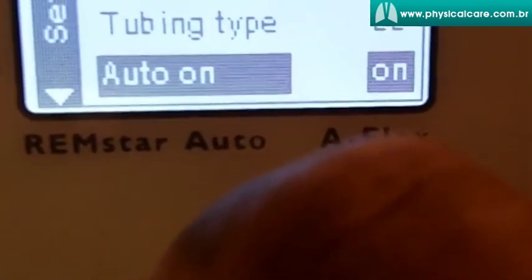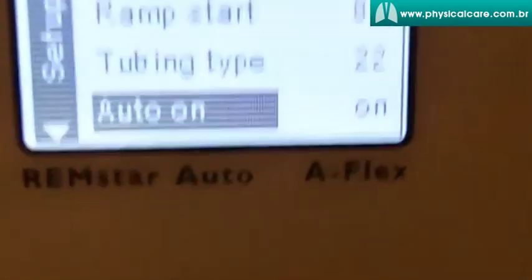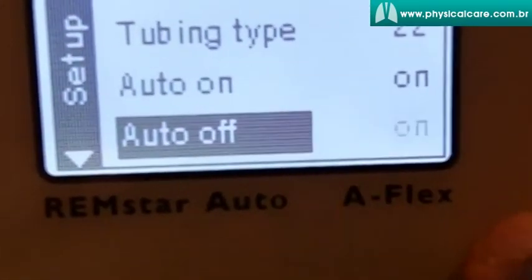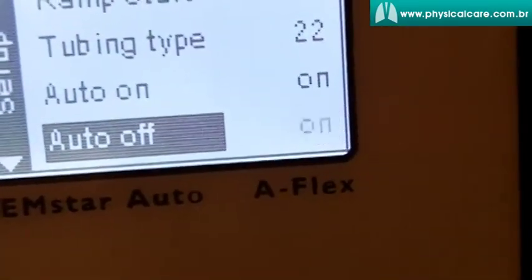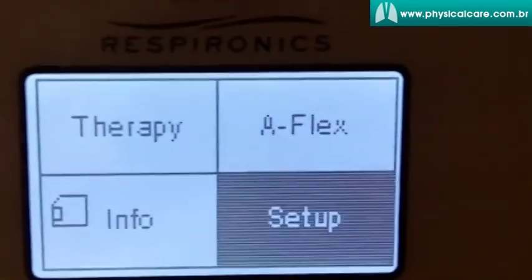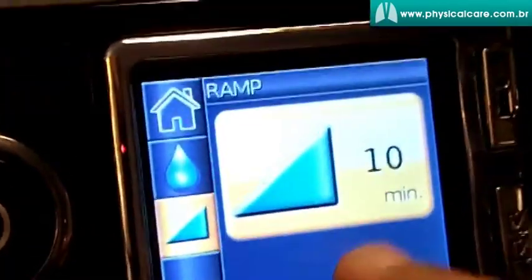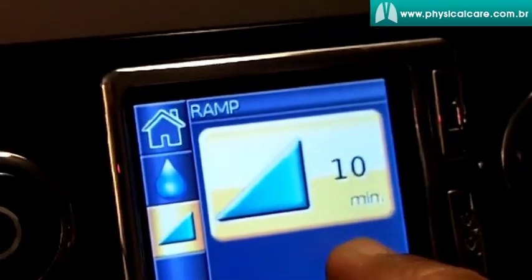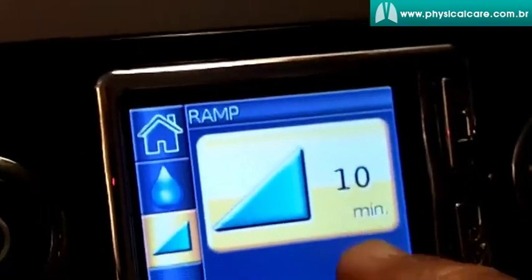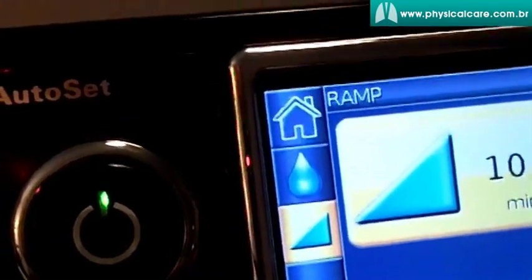Auto On — you can turn it on here, meaning all you have to do is put the mask on and start breathing and the machine will turn on. If you set Auto Off and turn that on, all you have to do is take the mask off your face and the machine will stop blowing air. The ResMed has that same feature; however, you cannot control it the way I showed you here — once the home care company turns it on, it stays on. Also, if you're using a full face mask, the auto on and auto off feature will not work in the ResMed.